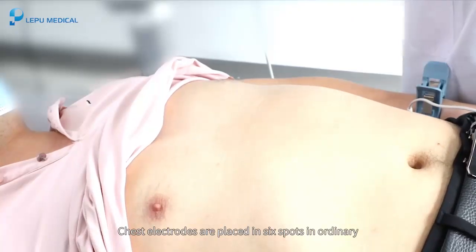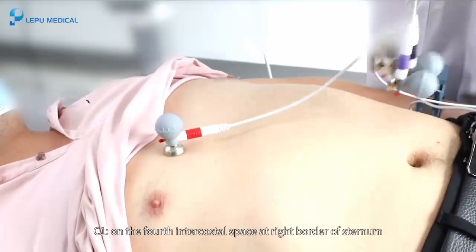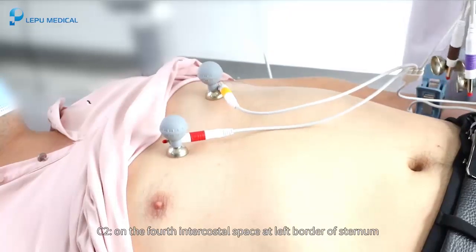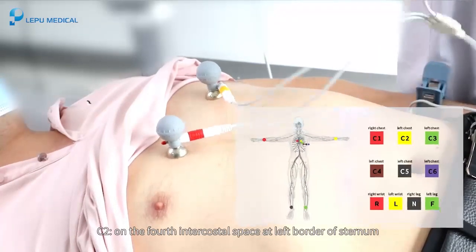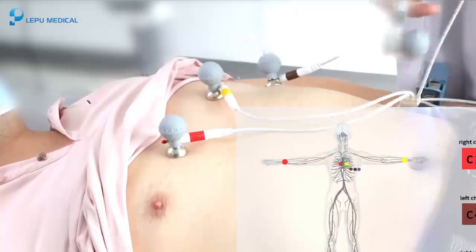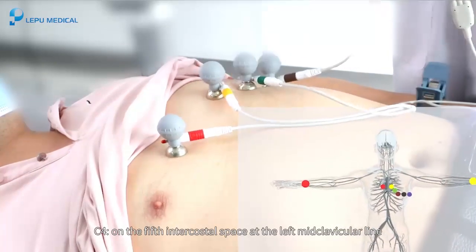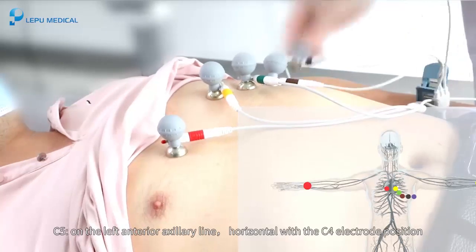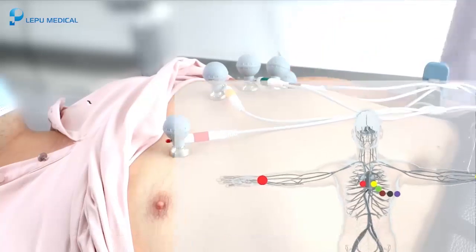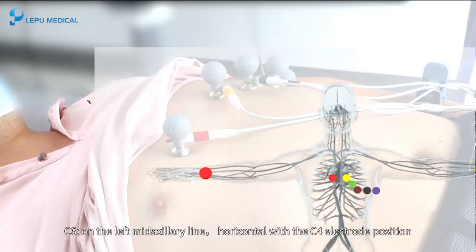Chest electrodes are placed in 6 spots. C1: on the 4th intercostal space at the right border of the sternum. C2: on the 4th intercostal space at the left border of the sternum. C3: midway between the C2 and C4 electrode positions. C4: on the 5th intercostal space at the left midclavicular line. C5: on the left anterior axillary line, horizontal with the C4 position. C6: on the left midaxillary line, horizontal with the C4 position.